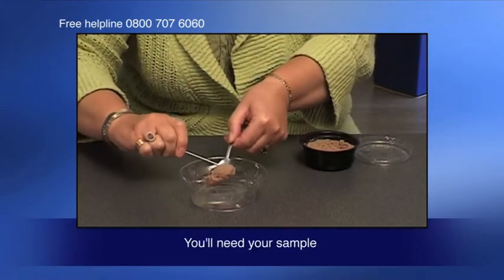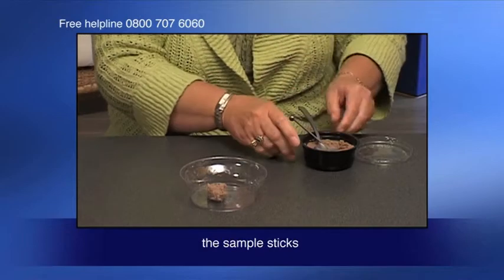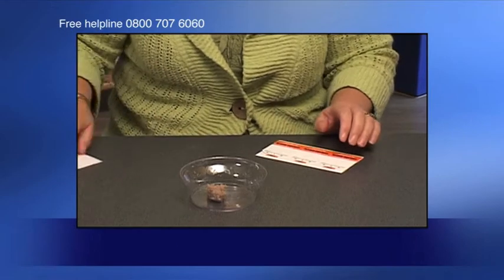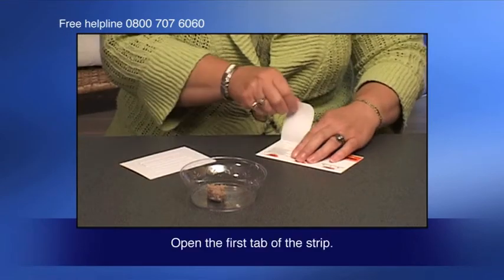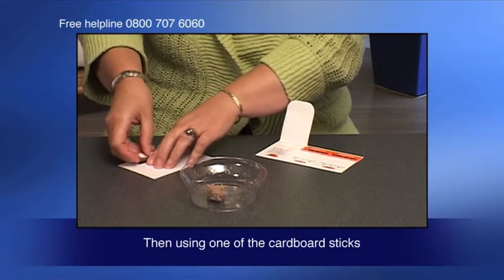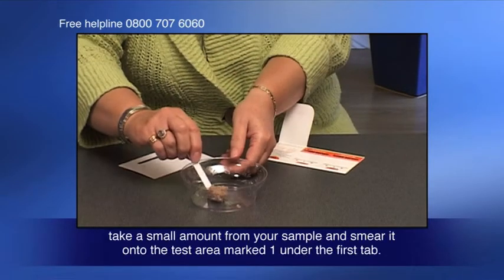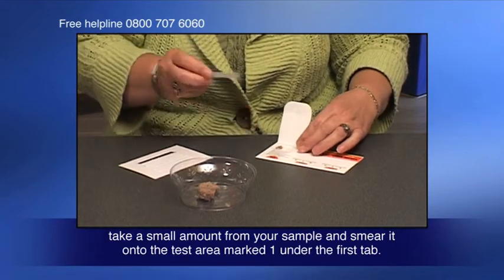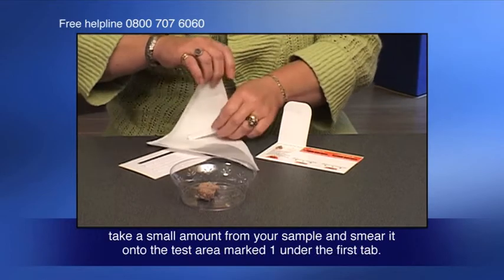You'll need your sample, the sample sticks and the test strip to hand. Open the first tab of the strip. Then, using one of the cardboard sticks, take a small amount from your sample and smear it onto the test area marked one under the first tab.